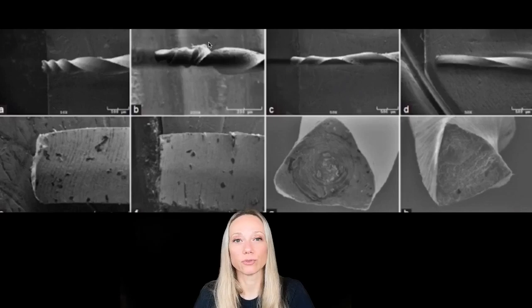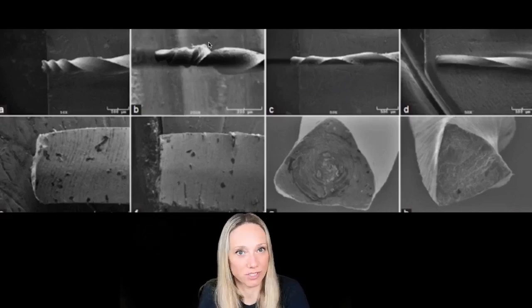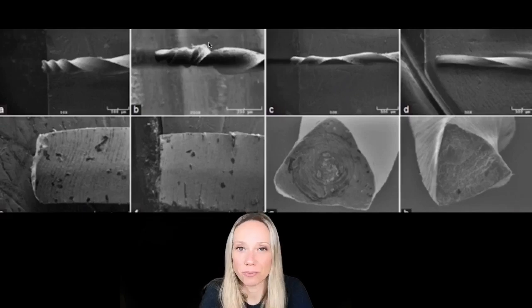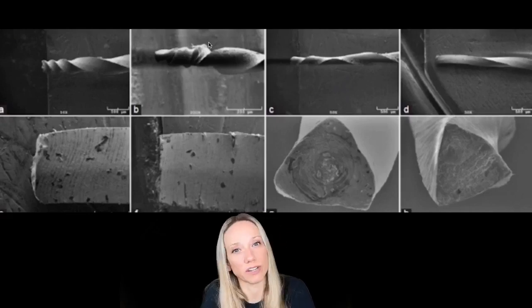I prefer to lose money, discard a file before, than have to retrieve a broken instrument later, because it's more time consuming, it's more difficult. I'm not sure that I'm going to bypass it, because it's not that we are able to treat every separated instrument in the canal. And so it's better to prevent.